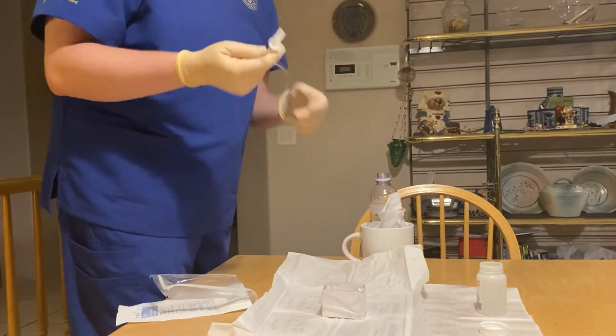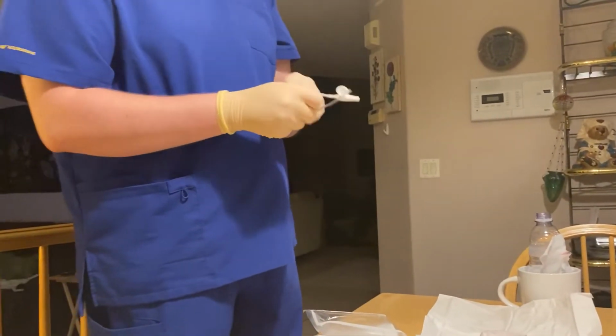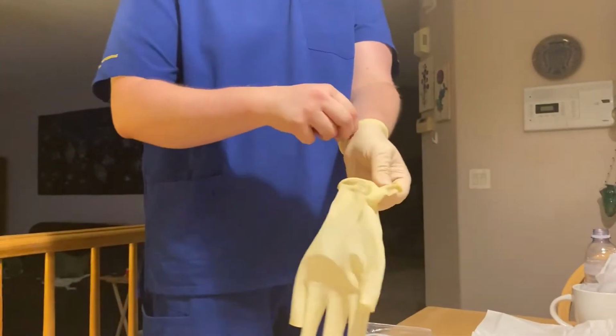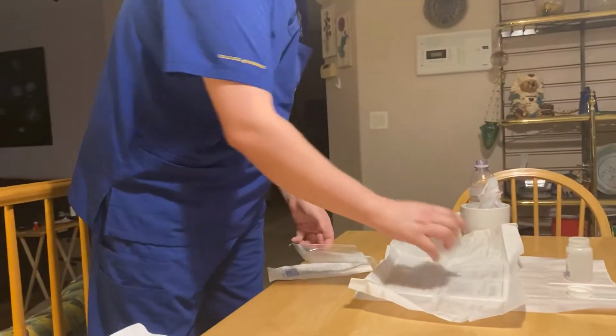So I would take this off, wrap this, put this into my glove, remove my gloves, throw them away, and remove everything else.